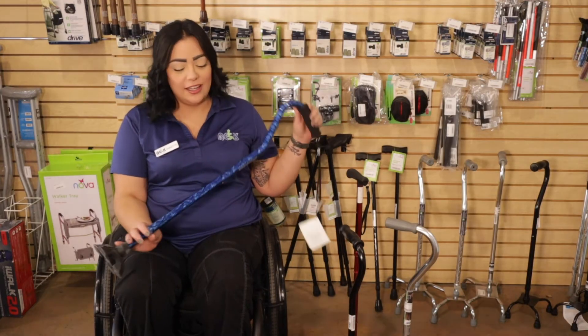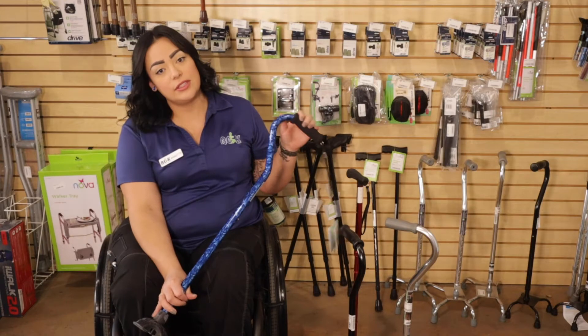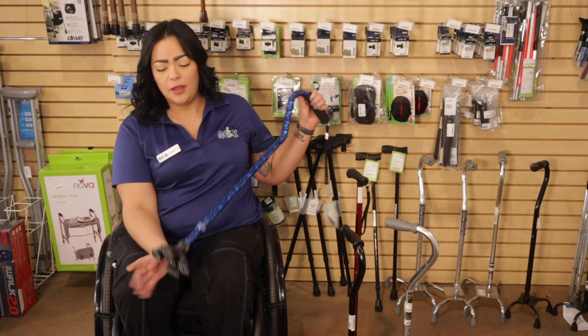We're talking about these kind of canes today. We have different colors, styles, and with different prongs.